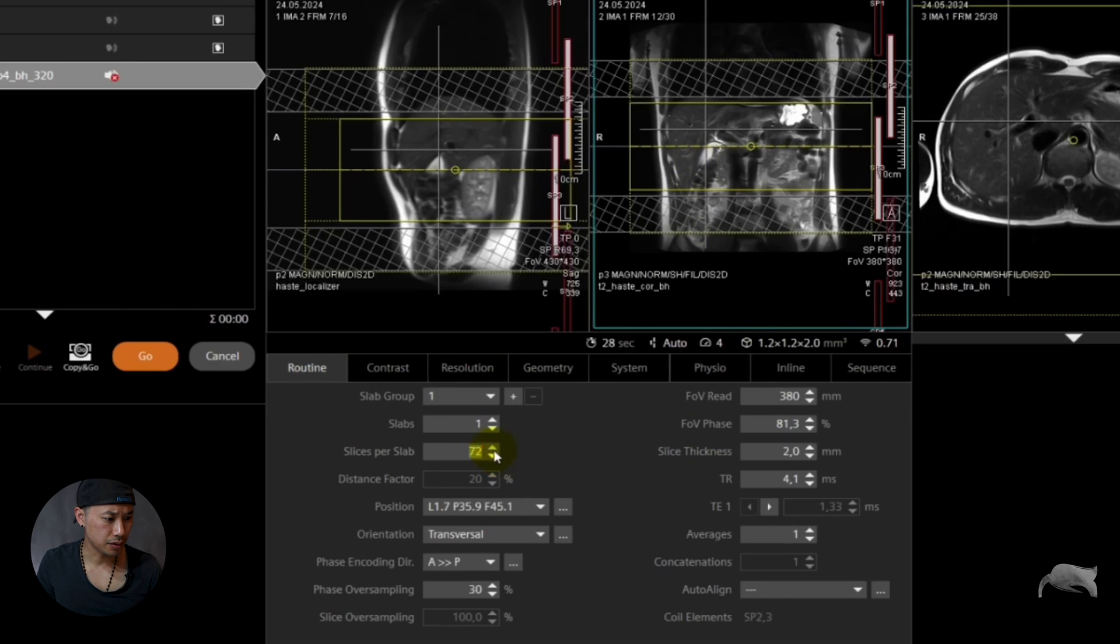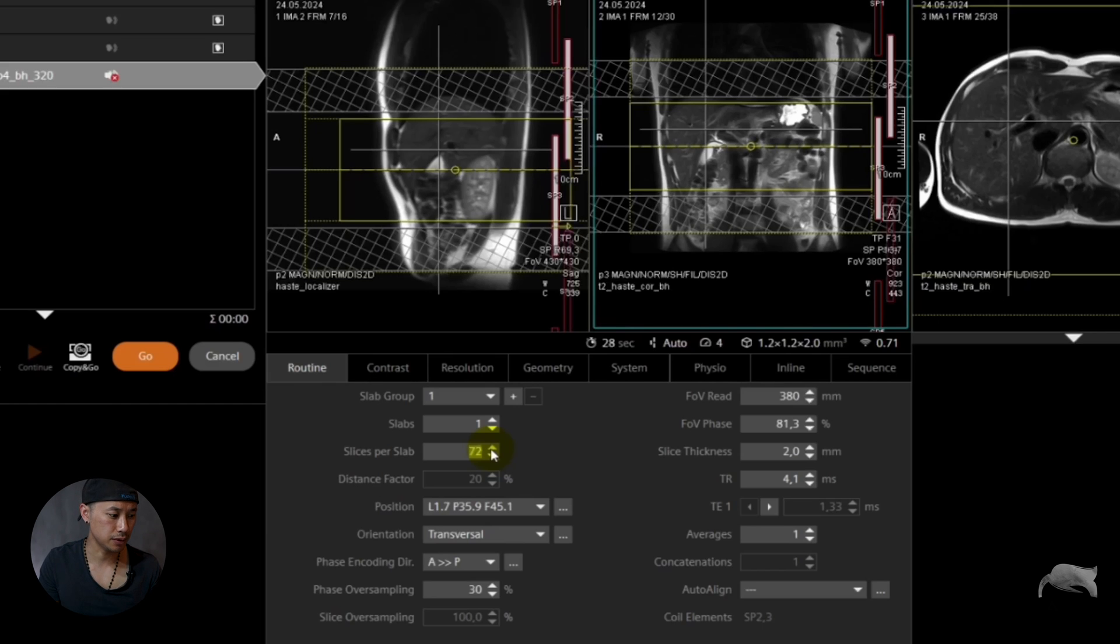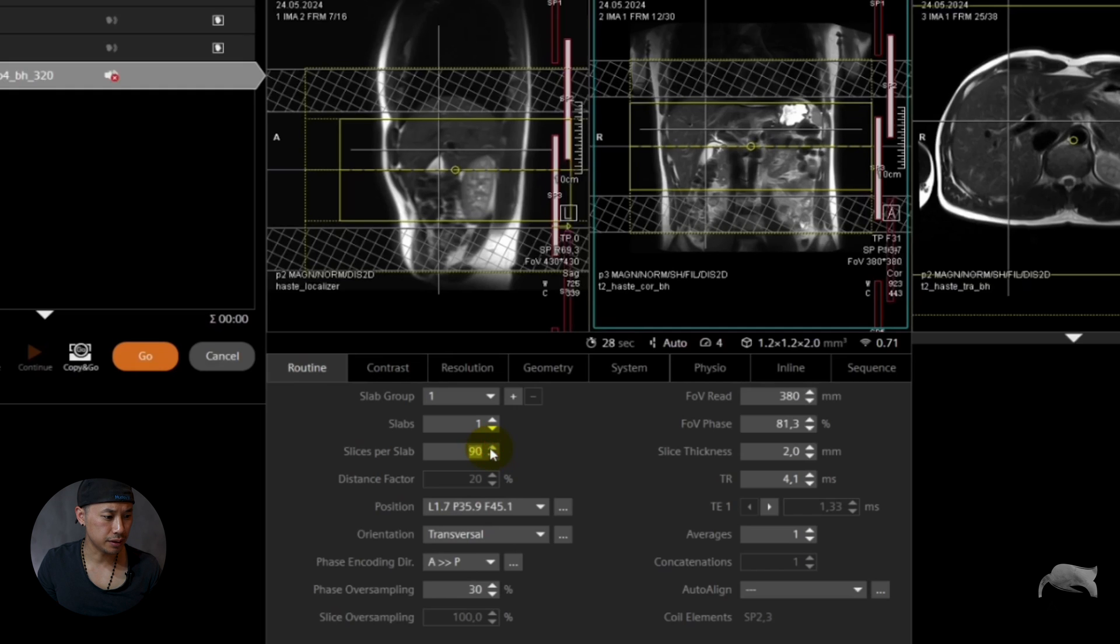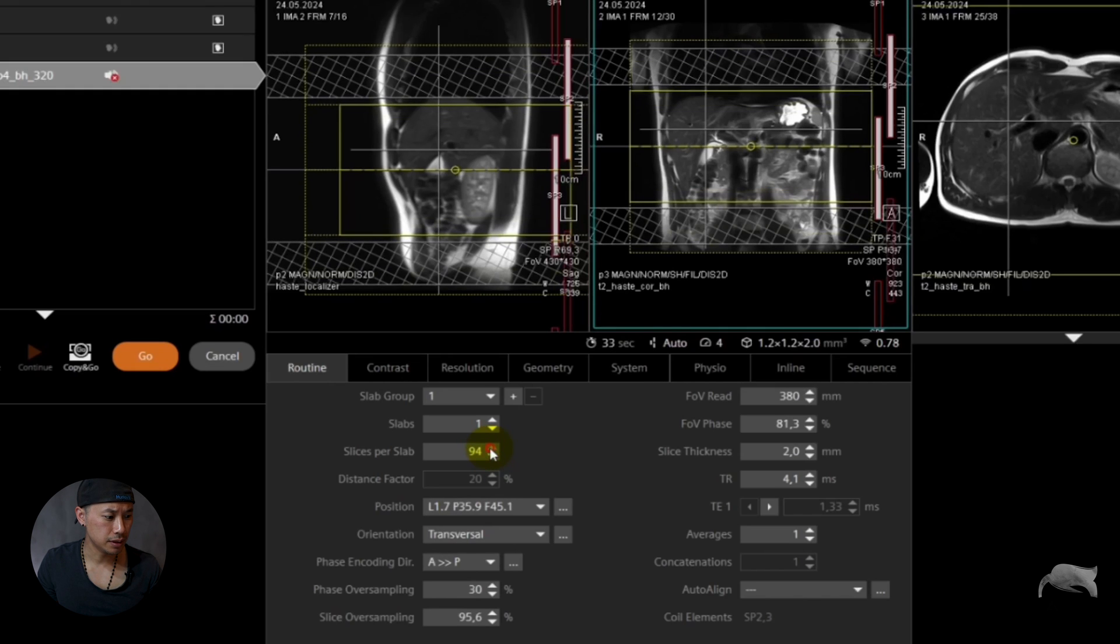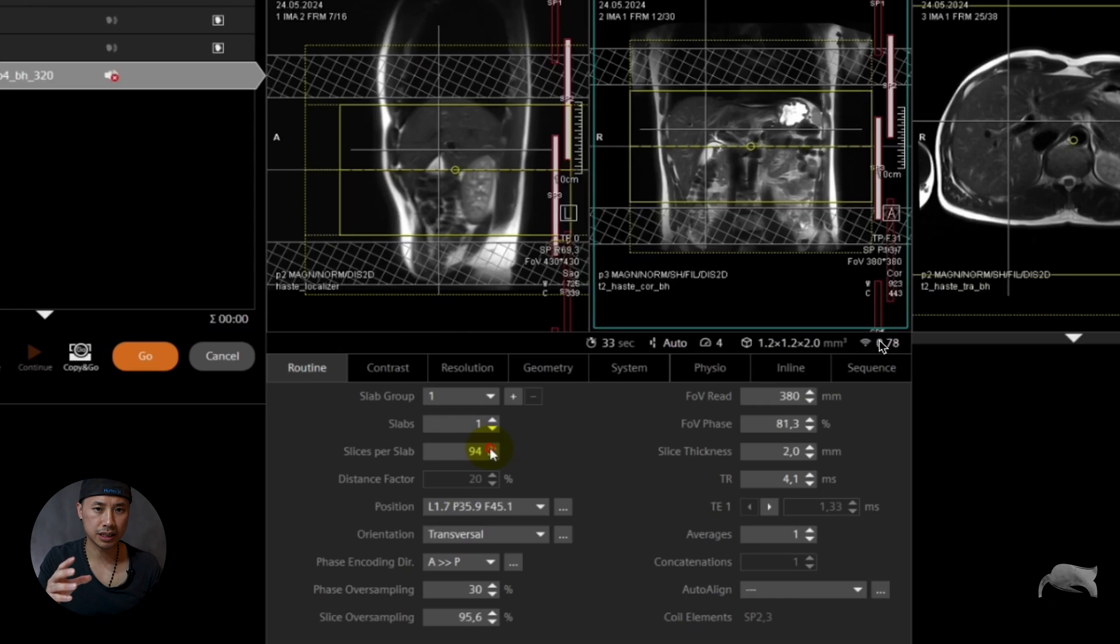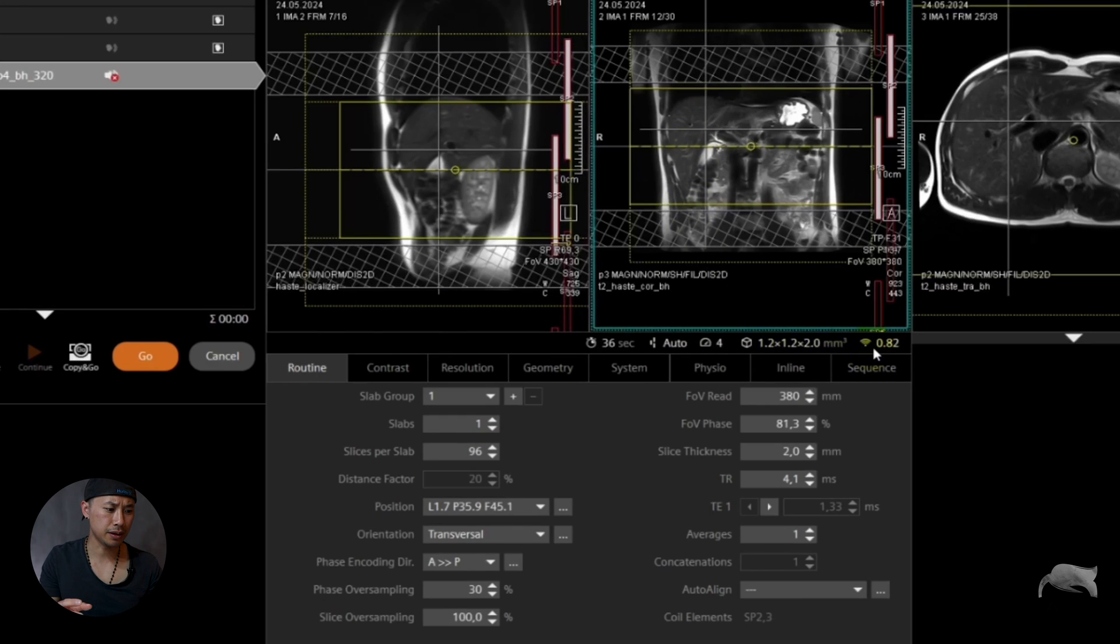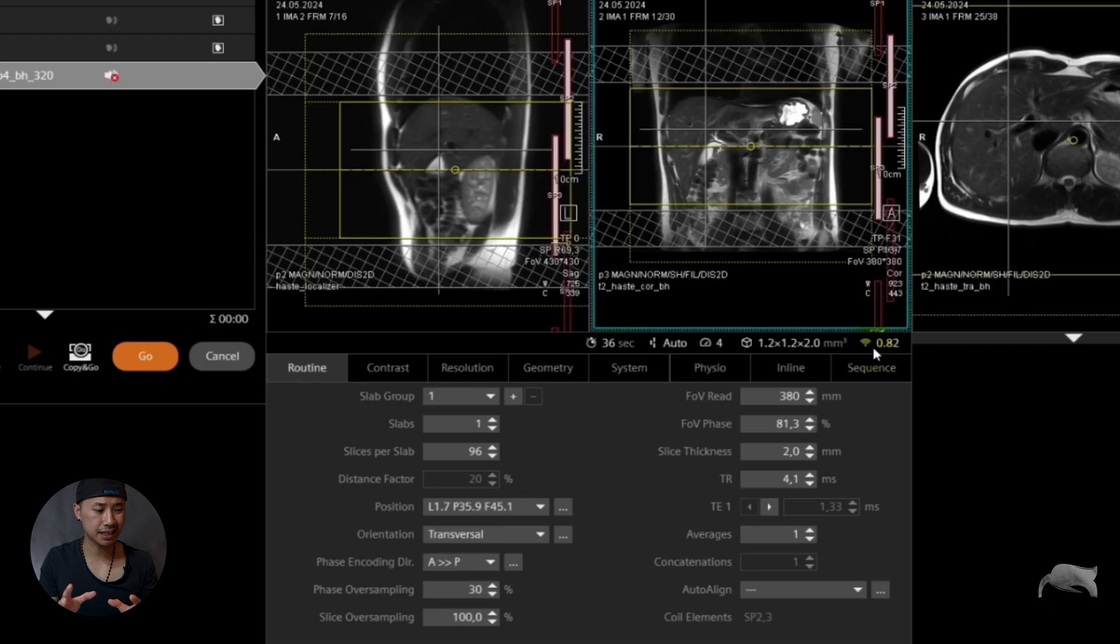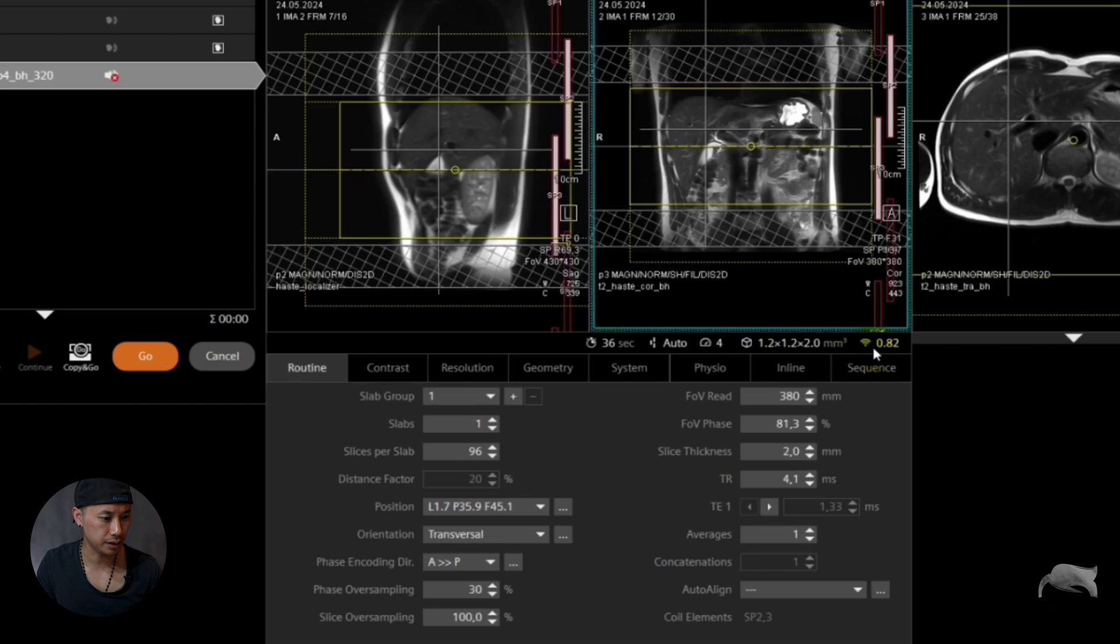So if you use the slices per slab, which is available on 3D, not 2D, 3D, so we increase here to cover the whole liver. While you're doing that you will also gain some SNR because this is a 3D sequence.